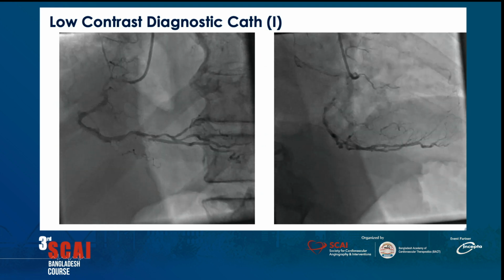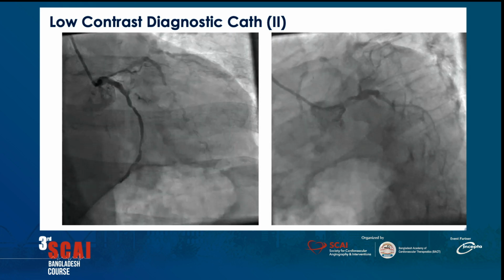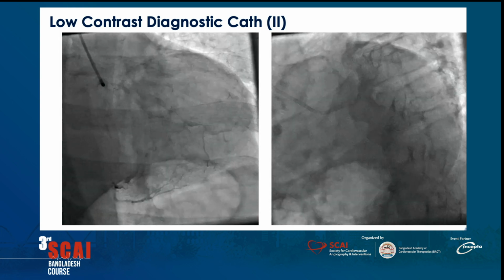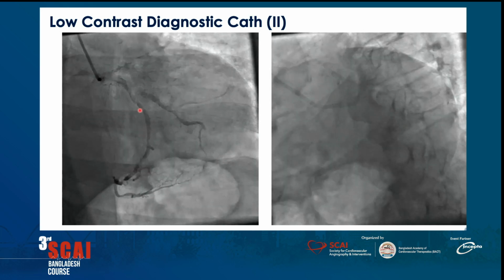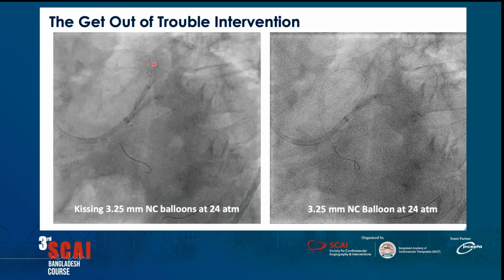These are his right coronary arteries. Not so bad. And then this is his circ and his LAD left main system, right? So he's got a tight lesion at the bifurcation, right at the ostium of both vessels. He's got a bunch of disease coming all the way down the circ. He's got a subtotal occlusion of the OM, and the LAD looks awful proximally.